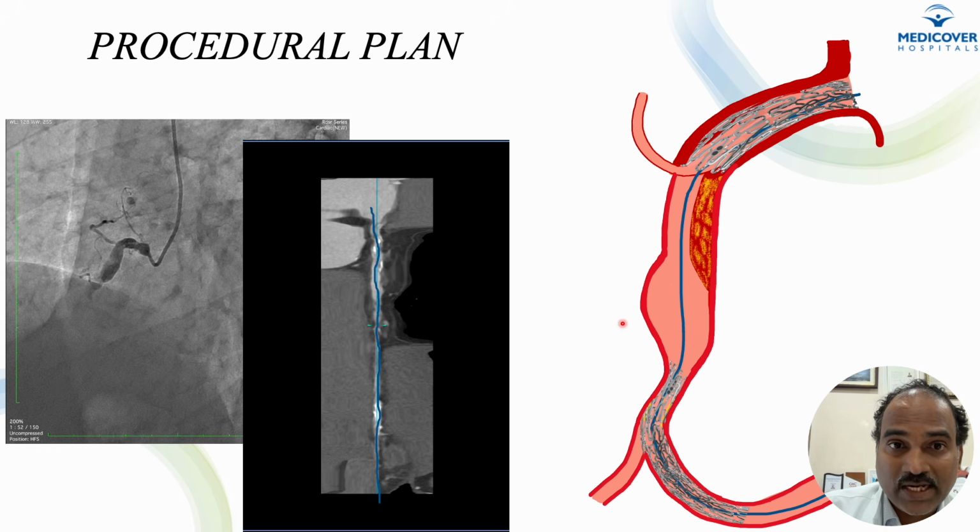Next, what is left here is just the pseudoaneurysm.